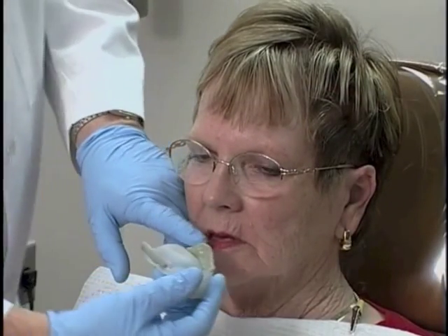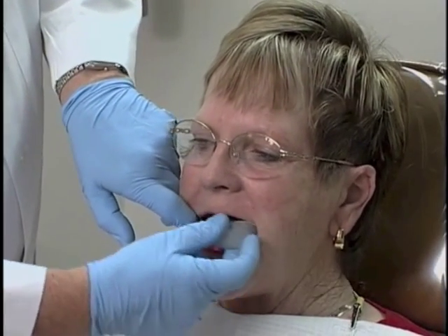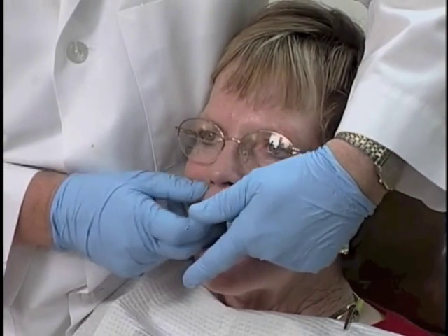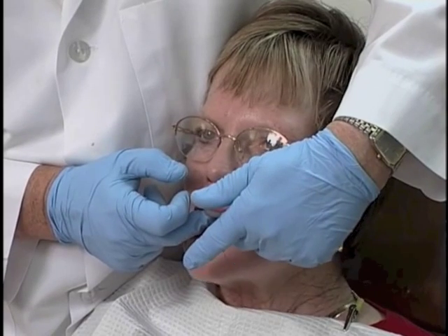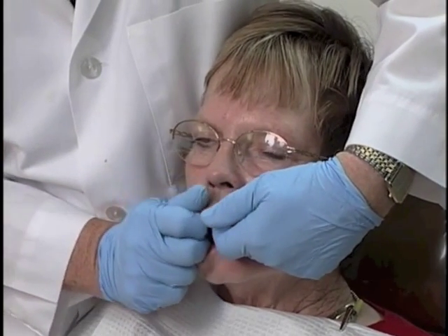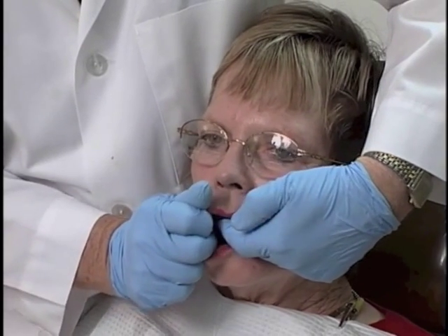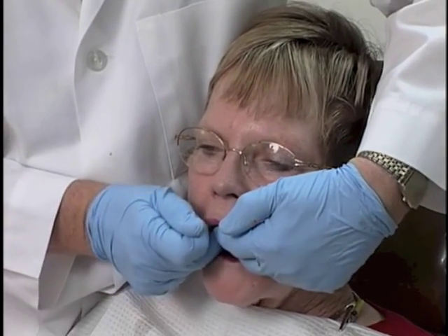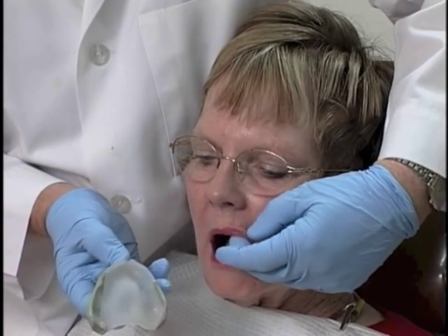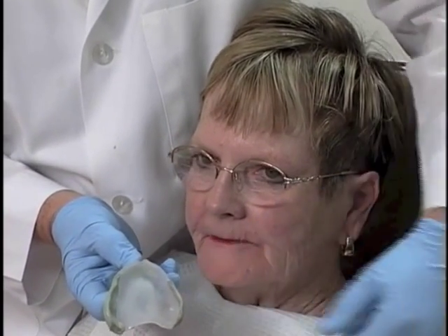So now we're going to the mouth with it. Rotate it into the mouth. Swing the chin from one side to the other. Very good. And relax your cheek and lips, and I manipulate the cheek and lips. And then we have our border molding done on the second portion.